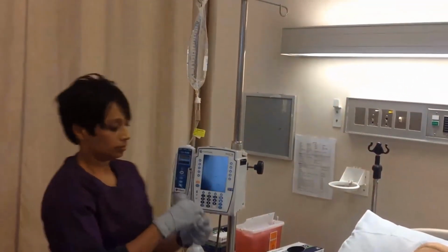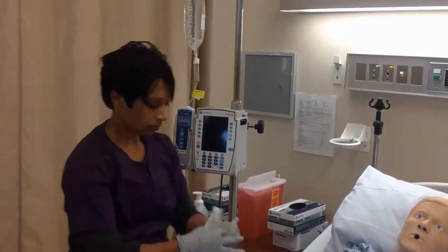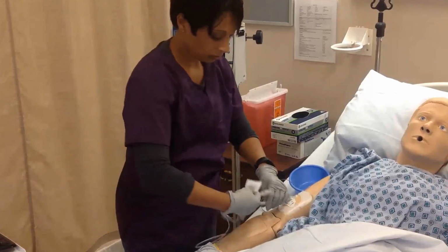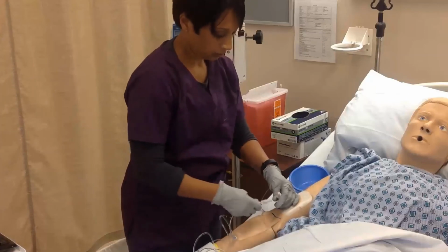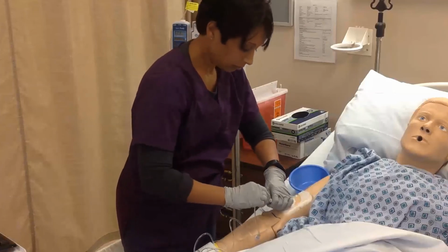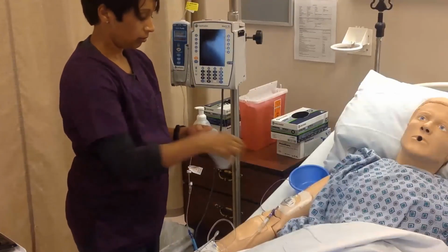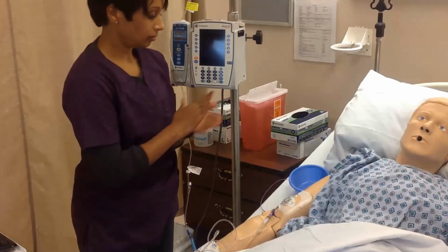Remove the syringe and vigorously wipe the port for 15 seconds with an alcohol wipe and allow to dry. Without contaminating the port, connect the tubing to the luer lock port using the push and turn method. Remove your gloves and wash your hands. You are now ready to insert the tubing into the pump.